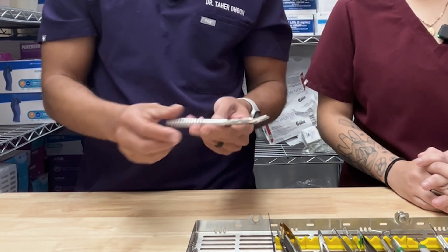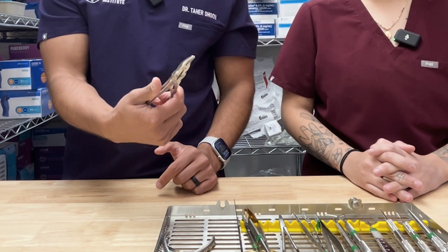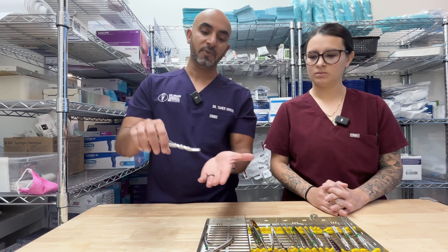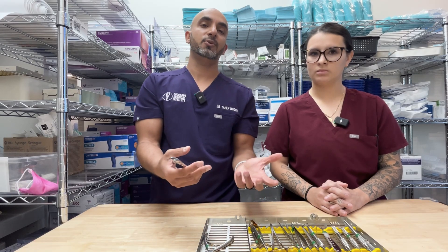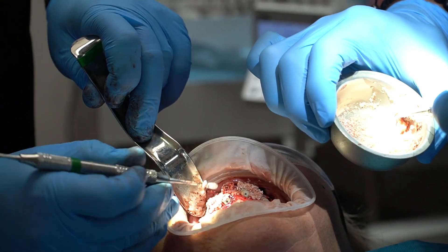We have a double action rongeur and we'll use this mainly for bone reduction. With the double hinge, there's too much pressure into the tooth if you try to remove a root tip. You can maybe grab some soft tissue, but you'll dull the blade. This blade needs to be used just to remove bone and do autogenous harvesting. We'll harvest autogenous bone and save it in a stainless steel dish with saline so it stays hydrated. Autogenous bone is osteoinductive, osteoconductive, and osteogenic — and it's free. We'll use a bone grinder to morselize it for use back in your osteotomies, and oftentimes we're mixing it with cortical cancellous.